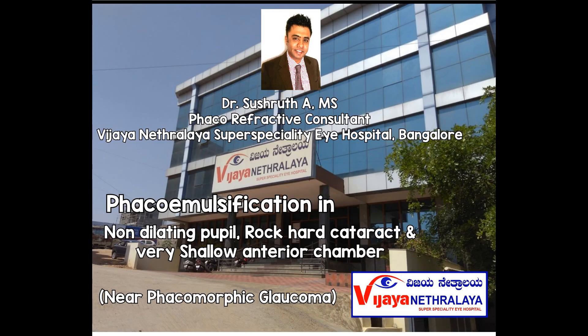Greetings everyone, I am Sushrut, consultant phaco-refractive surgeon at Vijayanetralaya Super Speciality Eye Hospital, Bangalore, India. In this video, I will be demonstrating phacoemulsification done in a non-dilating pupil with a rock-hard nuclear grade 4 cataract with a very shallow anterior chamber, which is almost near phacomorphic glaucoma.